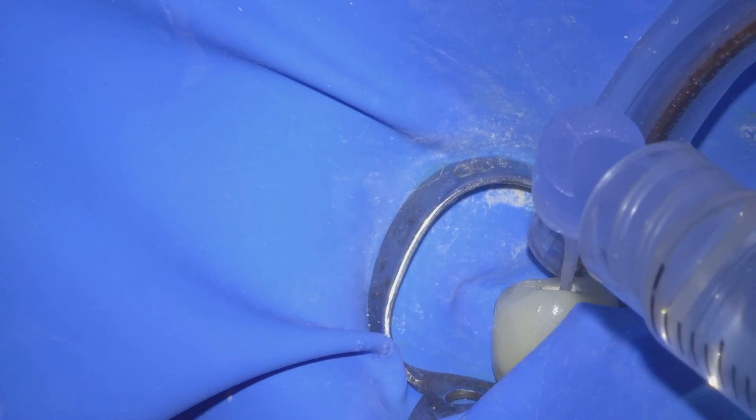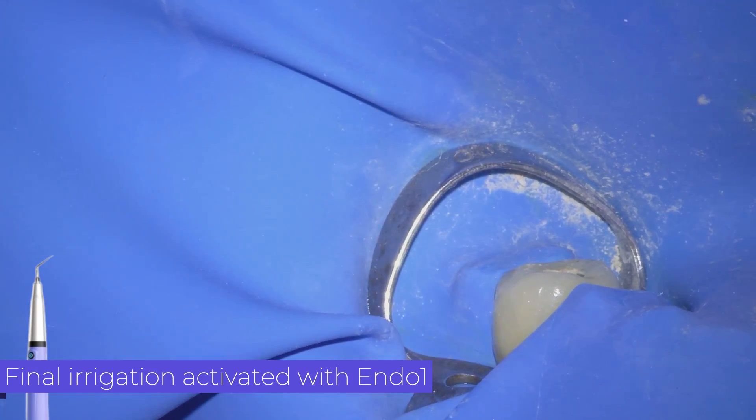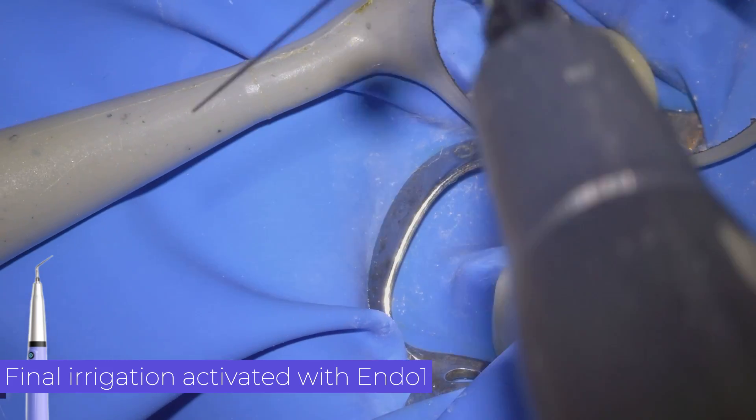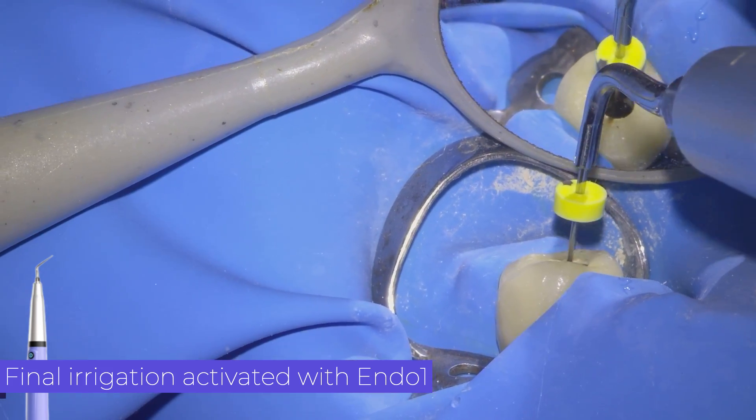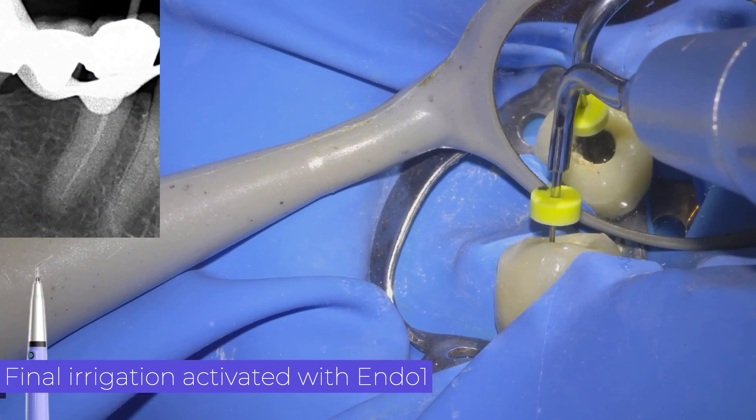Once we have verified that the master cone fits well, we carry out the final irrigation. In this case we perform ultrasonic irrigation, which consists of using ultrasonic energy on attachments that, when activated inside the canal, produce agitation of the irrigant.